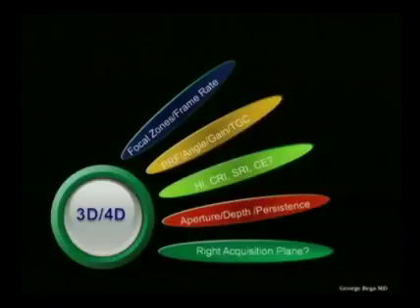Then important here to optimize are the harmonics, the compound resolution imaging, the speckle reduction, and coded excitation. These are all very important and useful pre-processing tools that improve contrast resolution, but they may have an impact on the frame rate. Also, the speckle reduction and compound resolution may slow down your acquisition speed. So there is always a trade-off between using them or avoiding them.